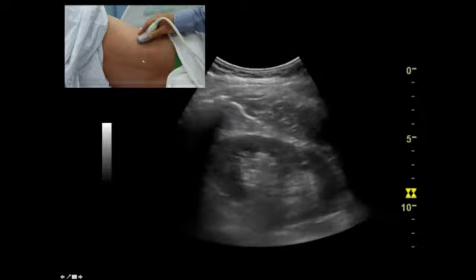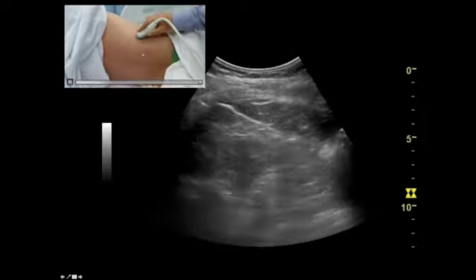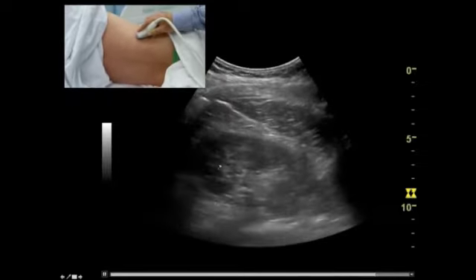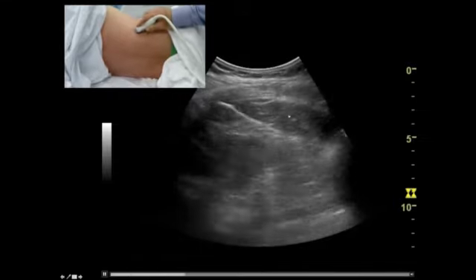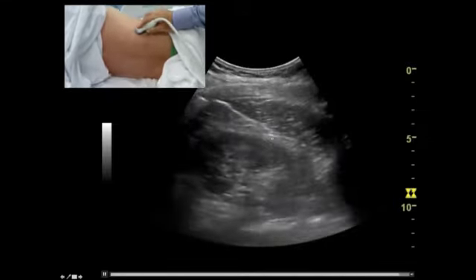You can even go posteriorly, but that often involves rolling the patient onto their side and trying to get a view from there. And you can see here we're still even posteriorly, when you're looking through those posterior muscles, you're getting a nice view of the kidney, rib getting in the way a bit there, but a posterior acoustic window if you need. So the right side, lots of opportunity to look through that liver.